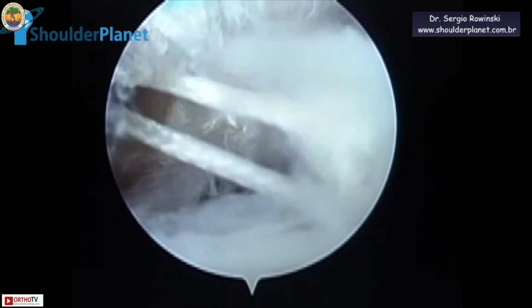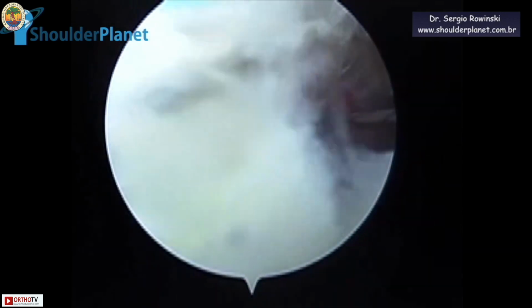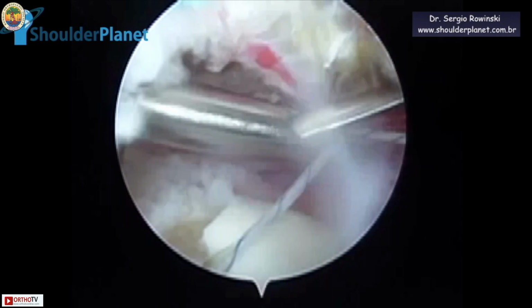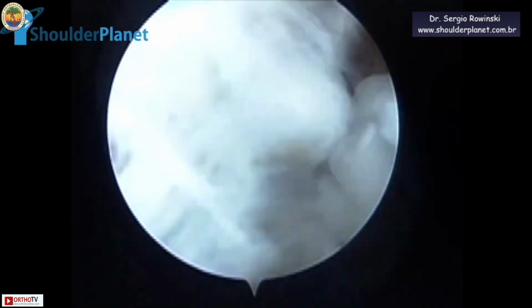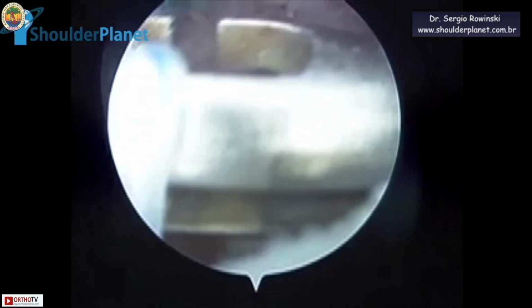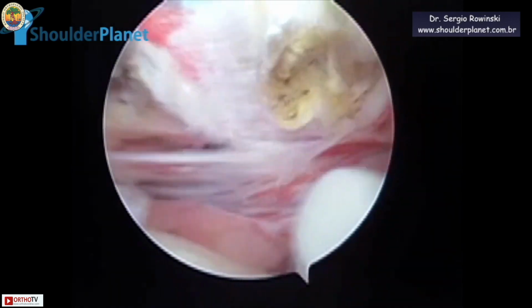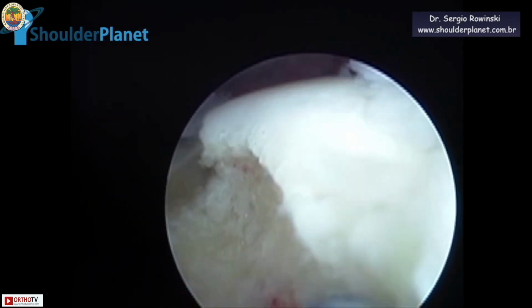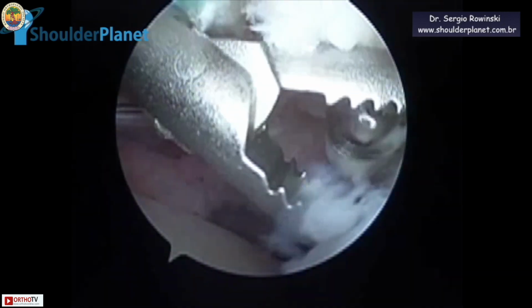Then we quickly moved the camera to the posterior portal and tied the first knot from the anterosuperolateral portal, and we then moved the camera back to the lateral portal, removed the sutures from the anterosuperolateral portal, and then we tied the second knot. After the knot was done, we had to reassess the tendon coverage, and still there was a reasonable part of the head to be covered, even with a medialized footprint.